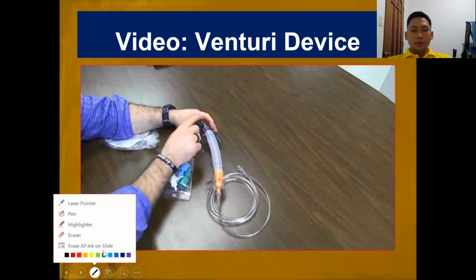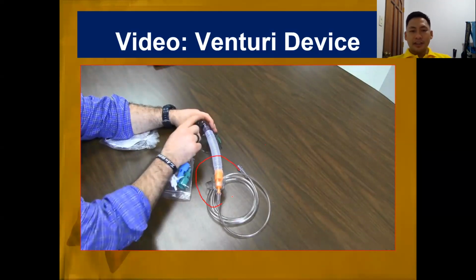Okay, so what is the purpose of this? You can put it on or not, this transparent piece. Because, the principle of Venturi is that it pulls atmospheric air. What if it gets covered? Then the oxygen delivery system will no longer be effective or accurate if the holes get covered. So what is the purpose of this? To protect this device from being blocked. It just stays there, so even if it gets pressed on, atmospheric air can still enter.